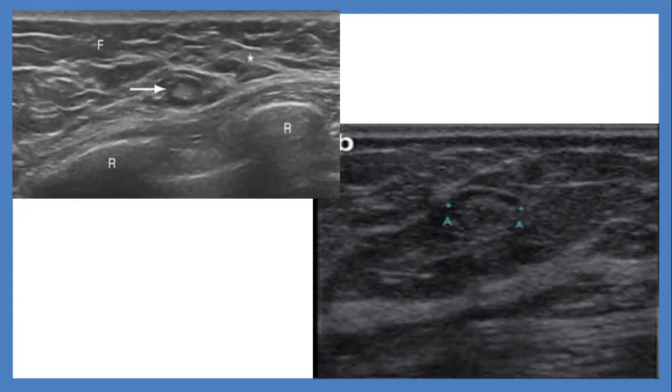The hilum echogenicity is equal to fibroglandular tissue, and the cortex is hypoechoic, not thickened, and uniform. And it looks like a small kidney shape.